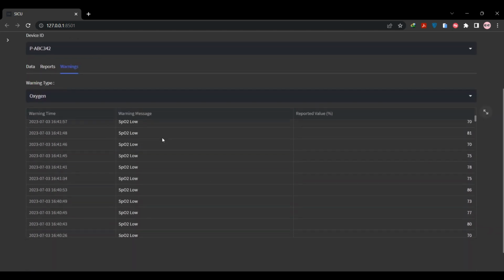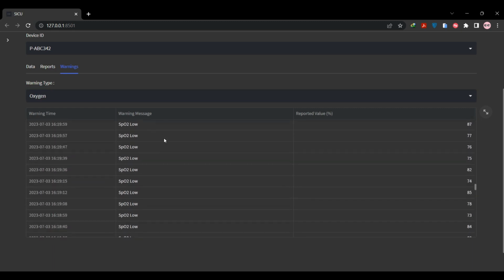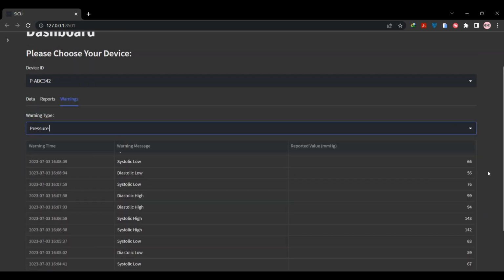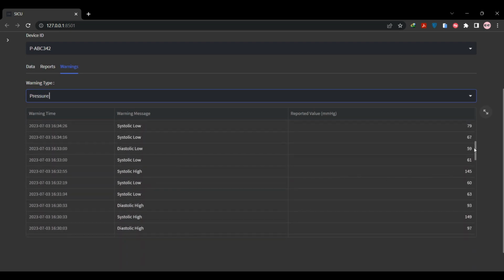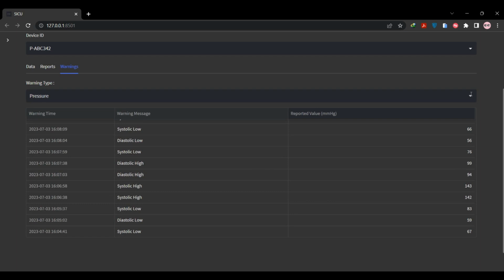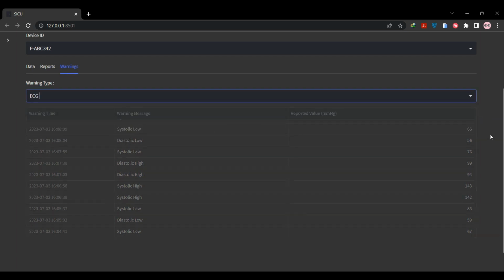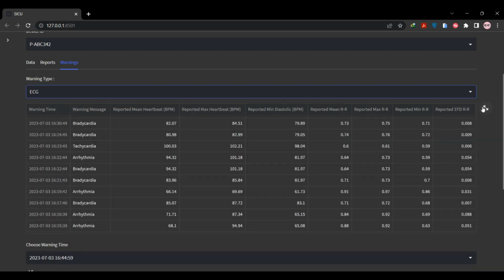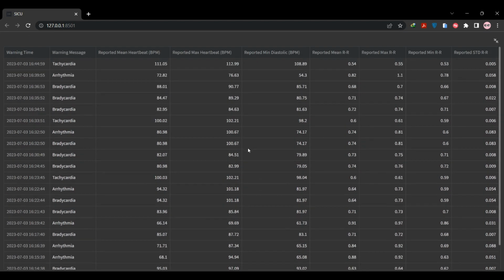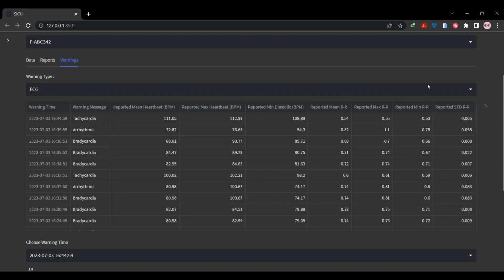In the warnings tab, you can specify the type of warning, including oxygen, pressure, and EKG, and you can see the full list of warnings that have been previously stored in our database associated with the device ID. The important point is, by choosing the warning type of EKG, you can also see the full envelope of the EKG during that warning time.